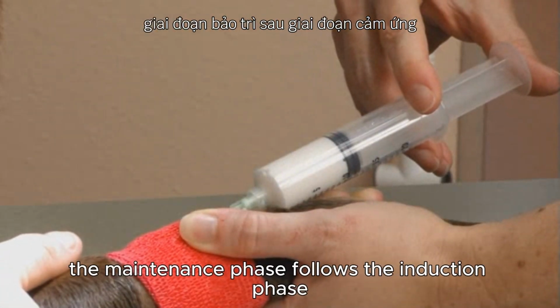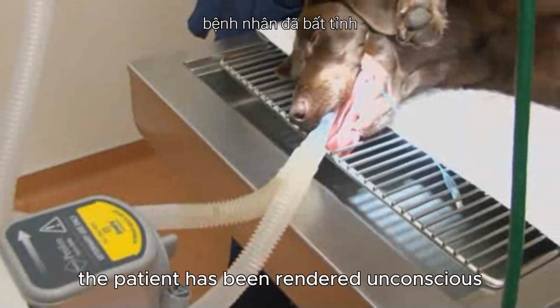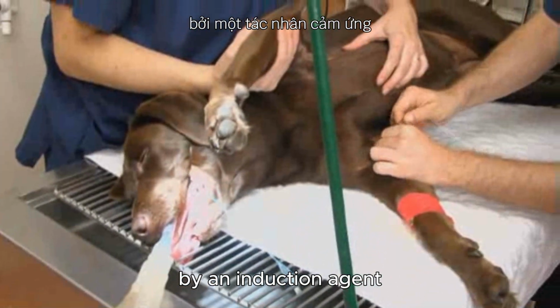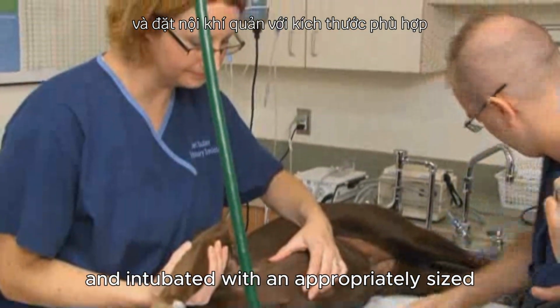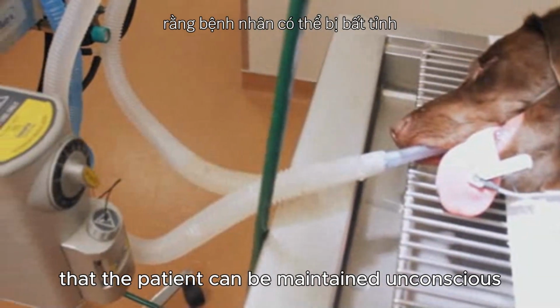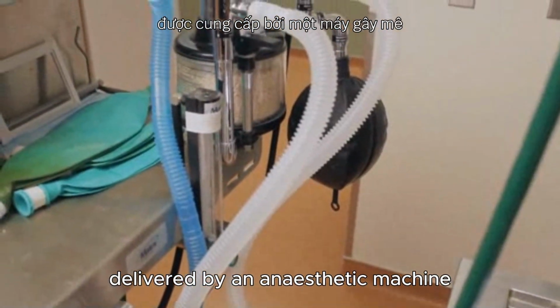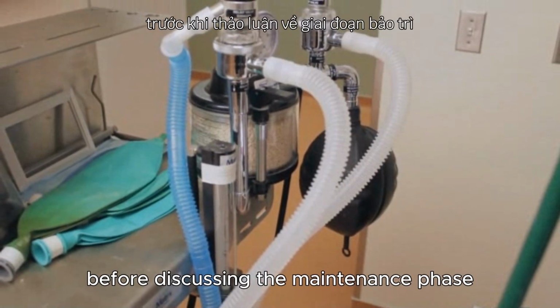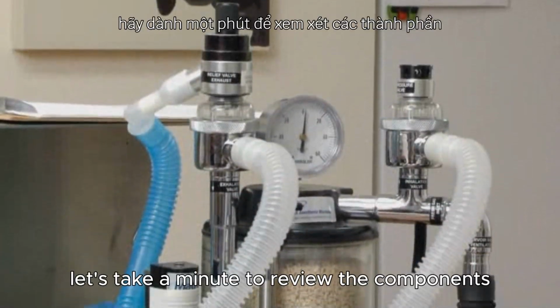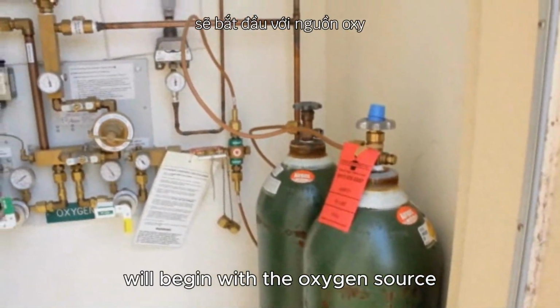The maintenance phase follows the induction phase. This phase begins after the patient has been rendered unconscious by an induction agent and intubated with an appropriately sized endotracheal tube. It is here that the patient can be maintained unconscious with the aid of an inhaled anesthetic delivered by an anesthetic machine. Before discussing the maintenance phase, let's take a minute to review the components and operation of the anesthetic machine. We'll begin with the oxygen source.